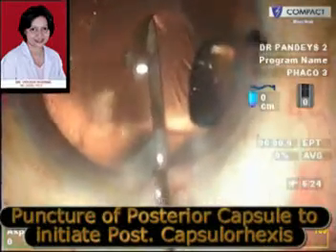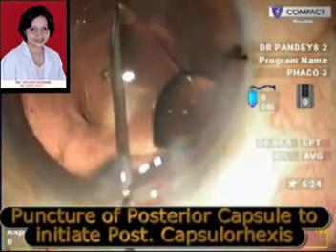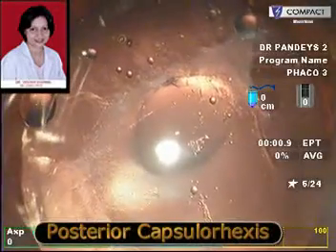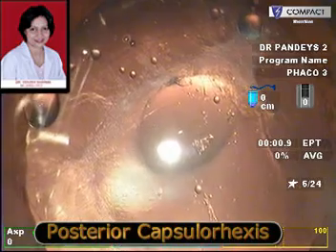The posterior capsule is being punctured with a 23G needle. It is difficult to perform a posterior capsular rhexis in a thick fibrotic capsule; however, it can be done with experience. We must be careful that this posterior capsular rhexis needs to be a small rhexis of about 4 mm in size so that the IOL that will be implanted into the capsular bag remains stable.